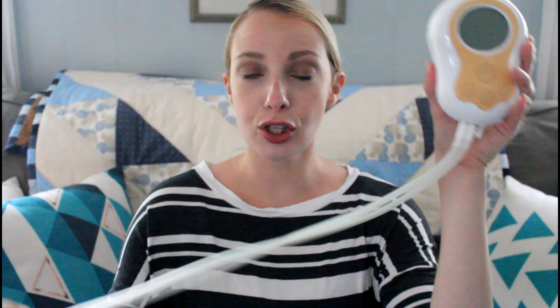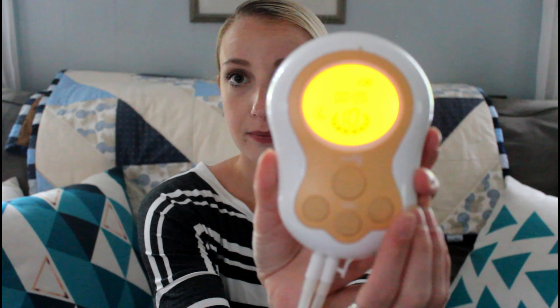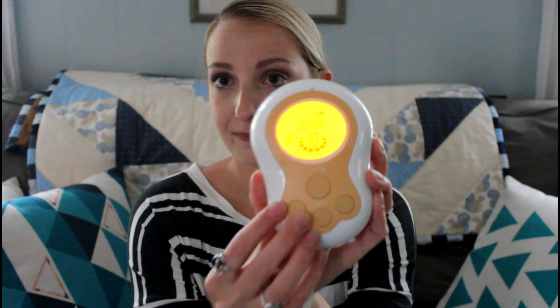This is what the pump looks like — this is the tubing. I actually just used the pump a little bit ago and I really like it. It's really cute and it does have a little scuff mark here because one of my kids knocked it off the table, and it still works great — so there's a plus. One of the things I really like about it is it's really, really quiet. I feel like it's the quietest pump that I own — let me turn it all the way up — yeah, it's really quiet.